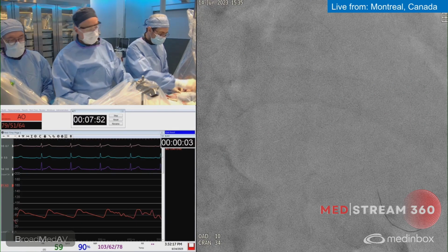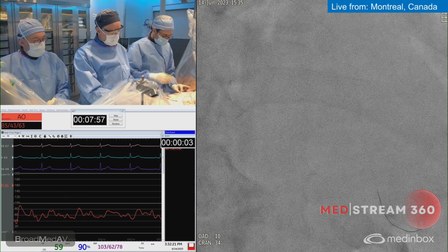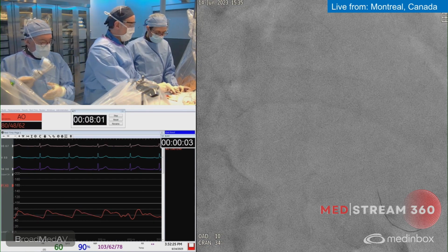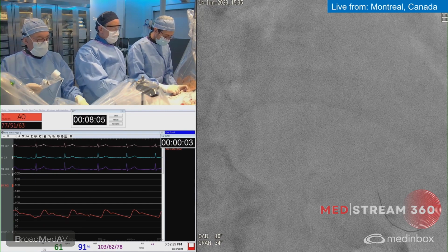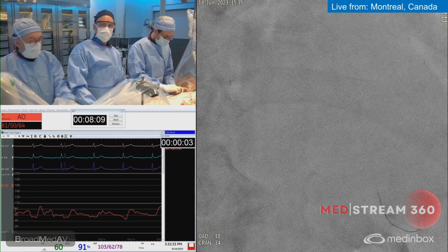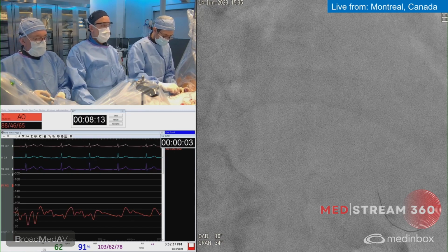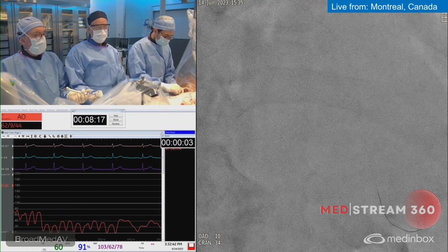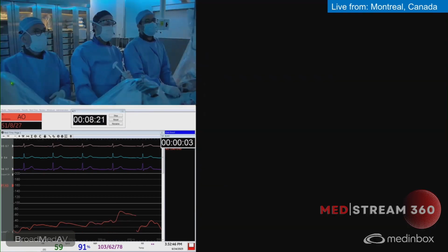And the other thing with orbital is that it's one size fits all, right? We don't have to switch burr. Exactly. With rotational atherectomy, we need to switch burrs. Orbital atherectomy just adapts to the size of the vessel, so it's one size fits all. And the other thing is that we don't want to have what we call orbital regret or rota regret. That means that if we try with the balloon and it doesn't work, and then we cause a dissection, then we're stuck, right? Orbital atherectomy and rotational atherectomy are in theory contraindicated if there's a dissection.